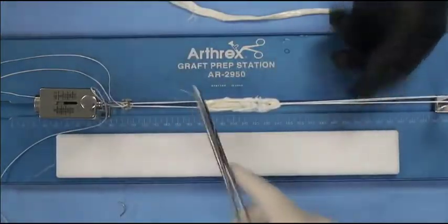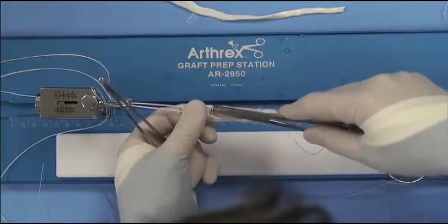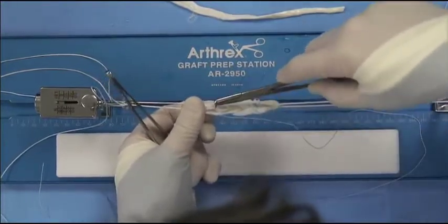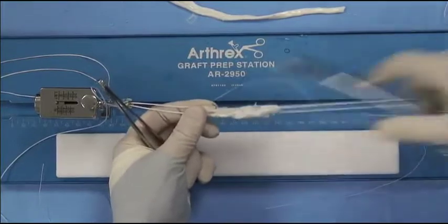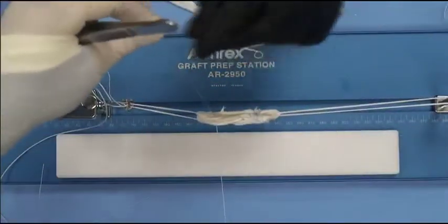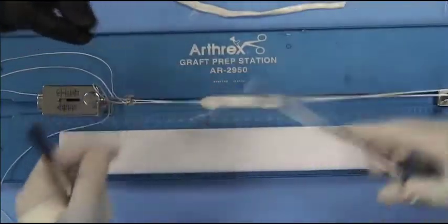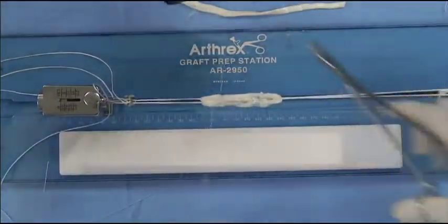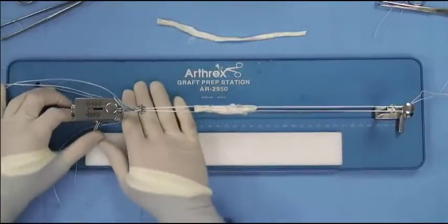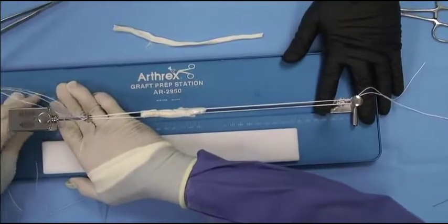And then on the femoral side, we're going to go ahead and use a buried knot technique. We're going to start in the middle, strand number 2, 3, 4, wrap it around 360 degrees, and come back through strand number 1. And now we'll go ahead and tie this. And you could put a second one of these on the femoral side. For the purposes of time, we're going to stop right there.